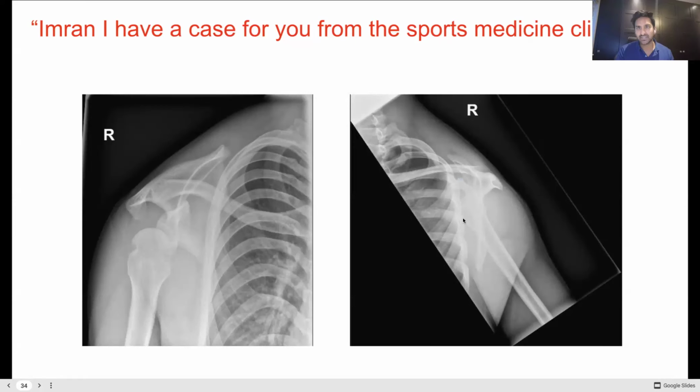And what you want to see is that there should be some overlap of the humeral head with the middle of the Y, or at least it should be pointing towards it in this direction. So we can see here that this humeral head goes all the way around like so and overlaps like this. And you can see that that Y is sitting right in the middle there. So this is a not dislocated shoulder. So great. Are we going to move on?